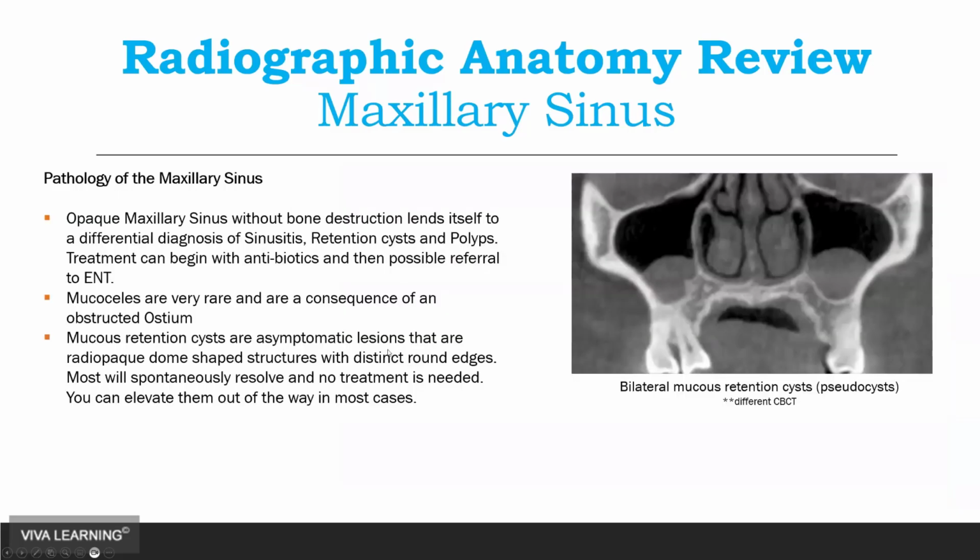Okay. So what are some of the pathologies you'll see? We've seen these all in panoramics, of course. Remember, dental school pathology class, we had to learn about these pseudocysts or these mucus retention cysts. Okay, they're generally dome-shaped, and they lie on the floor of the sinus, and they're pretty easy to detect and determine. They're completely benign. If you're going to do a sinus lift, the only thing you've got to make sure of is that by lifting the sinus, you're not going to then occlude the ostium, which you can see here.